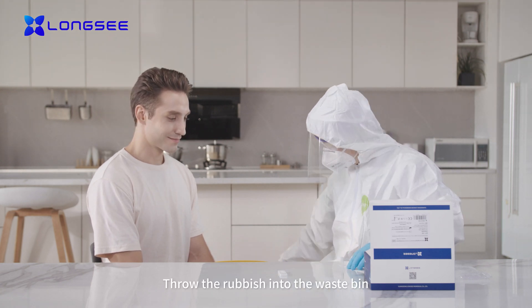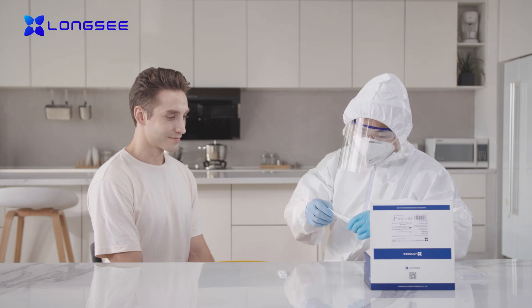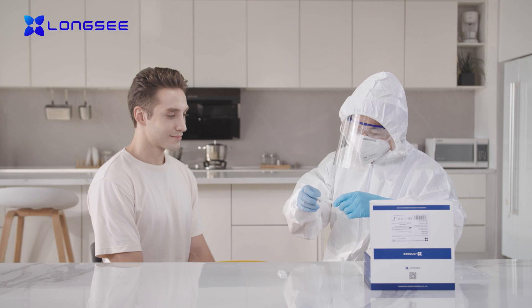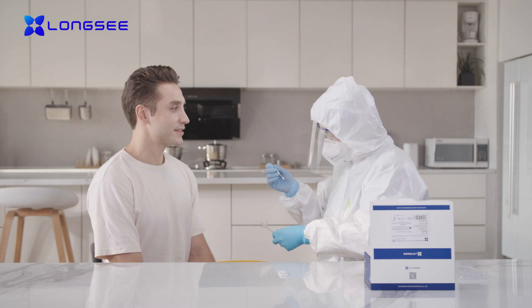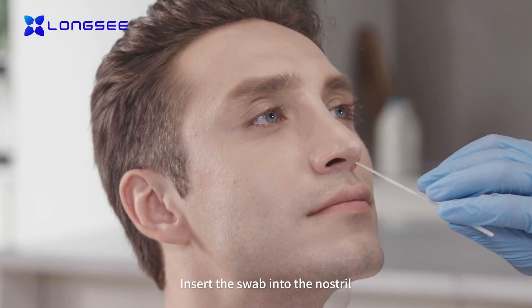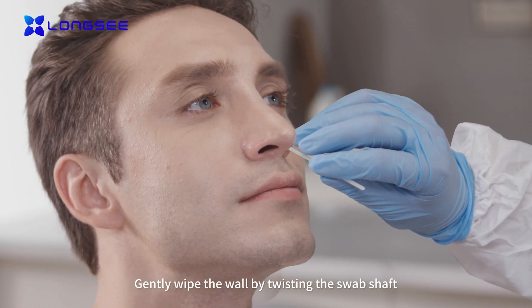Throw the rubbish into the waste bin. Take out the swab gently. Insert the swab into the nostril. Gently wipe the wall by twisting the swab shaft.